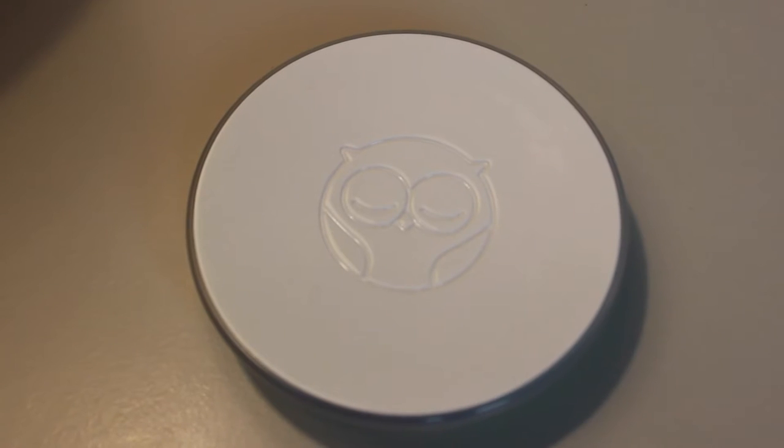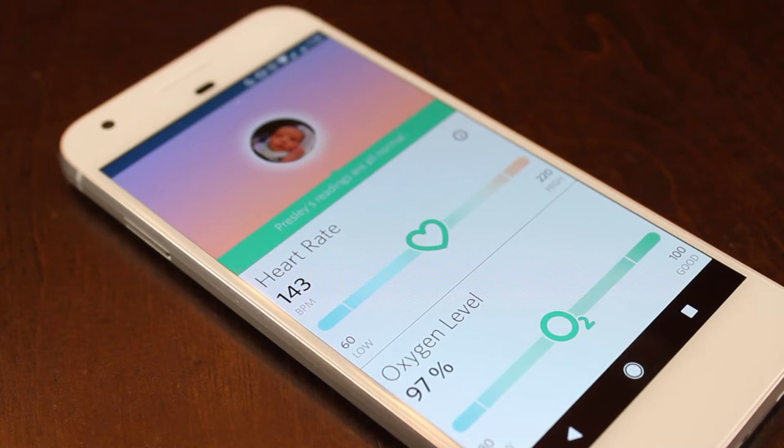The base station is the heart of Owlet. It's designed to notify you if your baby's heart rate or oxygen levels get too low or too high. For the heart rate, if it gets below 60 beats per minute or above 220 beats per minute, you'll be notified. For the oxygen level, if it gets below 80, you're going to get notified. Not only will your base station light up and play a noise, but you'll also get notifications on your phone if something goes wrong.